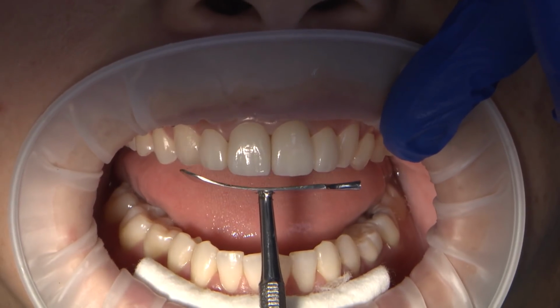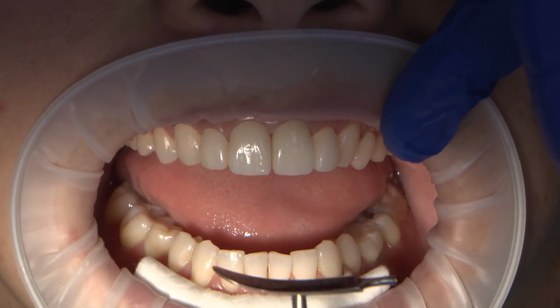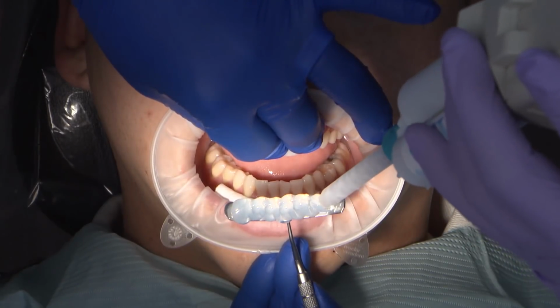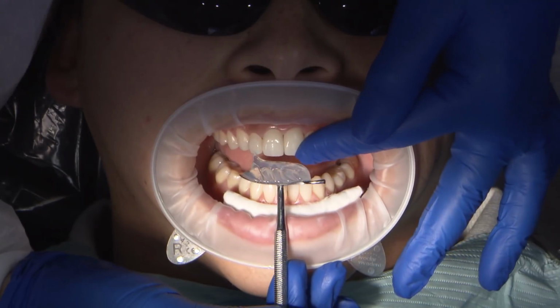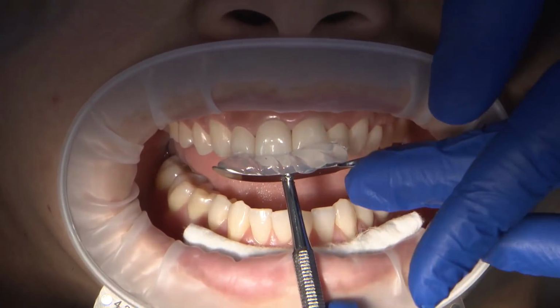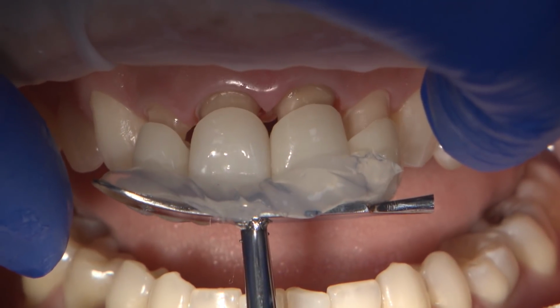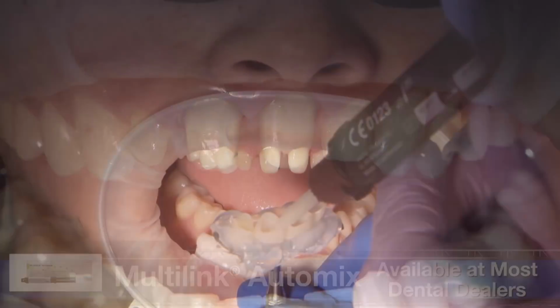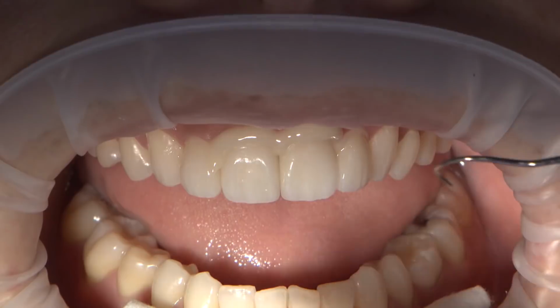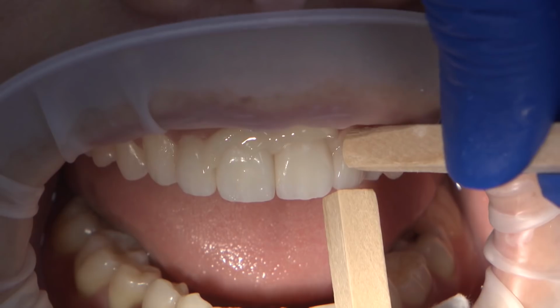I use this dental spatula, repurposed into an instrument meant to carry all final restorations to seat simultaneously during the bonding procedure. Transparent silicone bite registration material was placed on the flat side of the instrument to secure the crown and the veneer into the correct position. Once the silicone had set, all of the restorations were removed simultaneously and loaded with multi-link cement. After an easy detachment from the tray using an explorer, I verified complete seating of the restorations using wooden sticks.